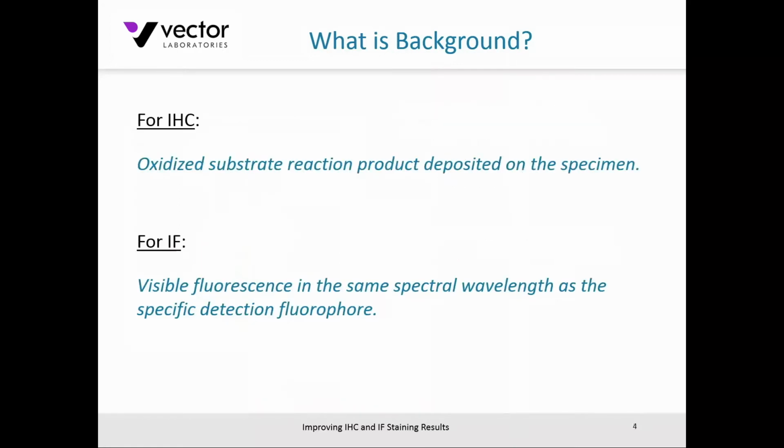So just to clarify a little bit for investigators that might be new to the field and are listening in, what is it I'm referring to about background in IHC or immunohistochemistry? It's the oxidized substrate reaction product that's precipitated out or deposited on that particular specimen, whether it be a section, for example, or cell prep. And the example would be, say, a brown DAB staining, diaminobenzidine staining.